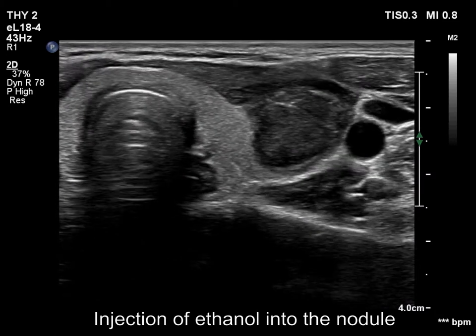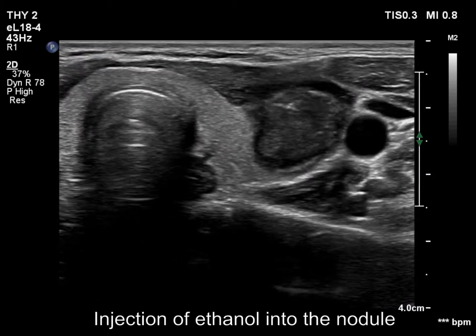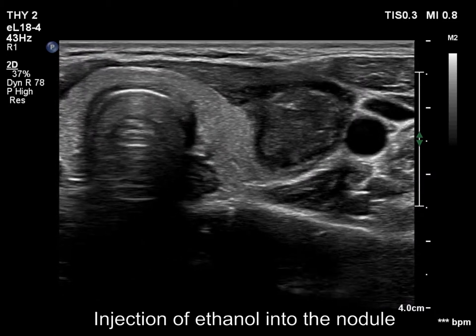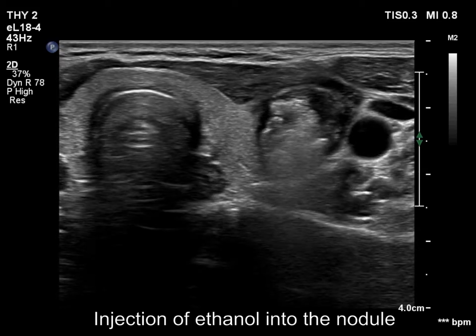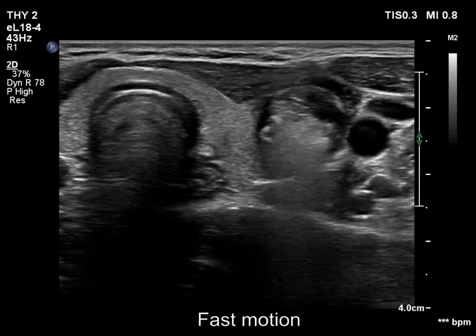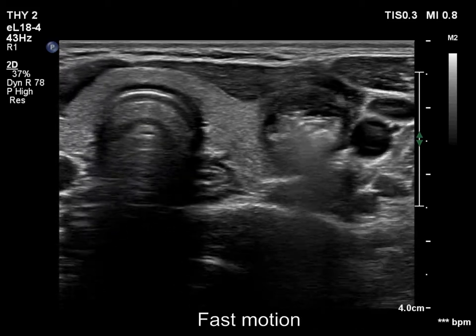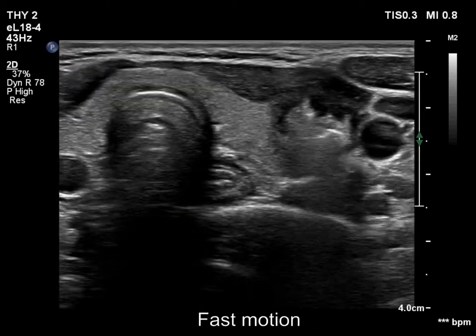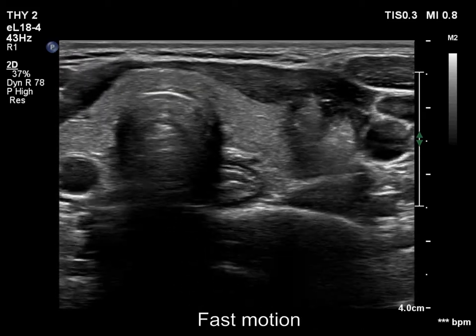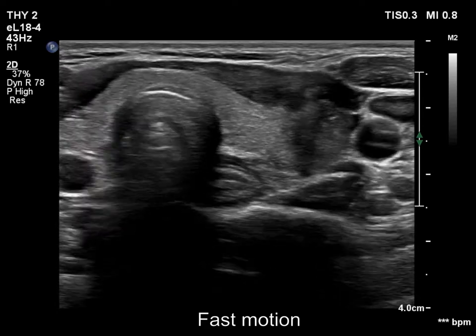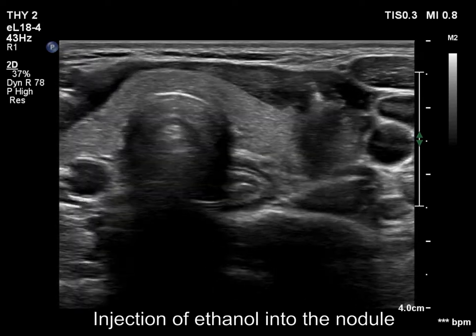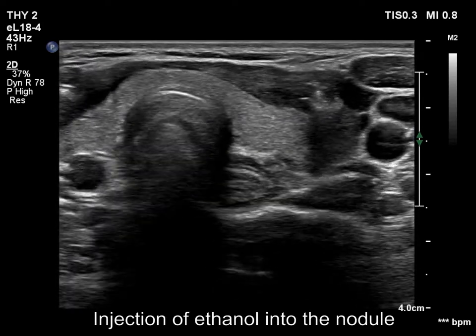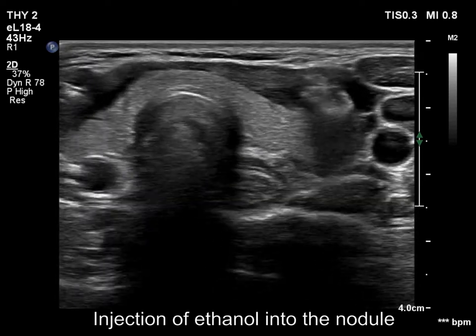The tip of the needle became visible, so we start with the injection. At the end of the process, the cloudy mass appeared even ventral to the nodule, which means that the alcohol has leaked through the channel of the needle.